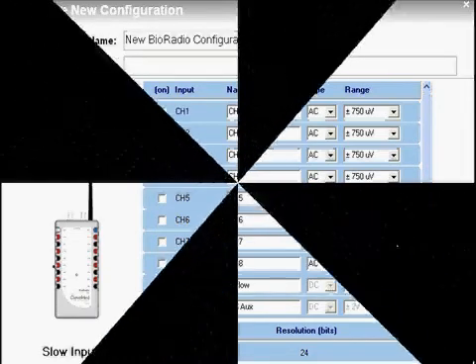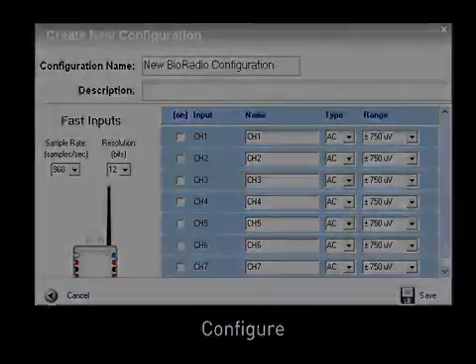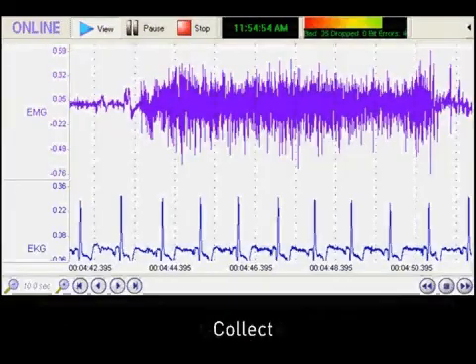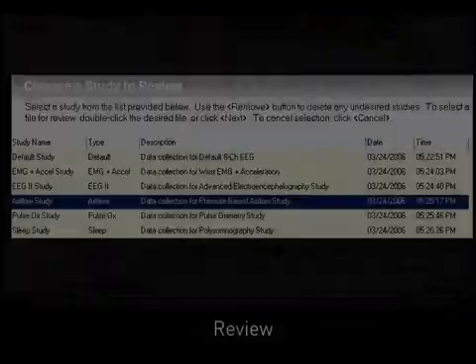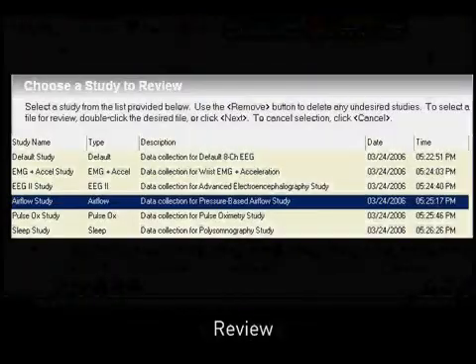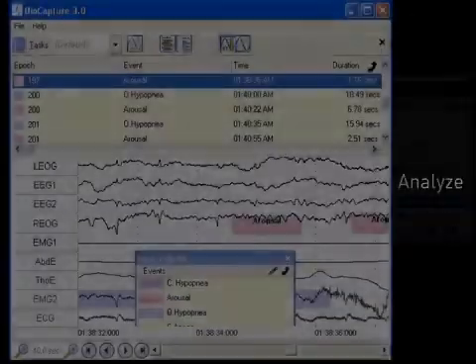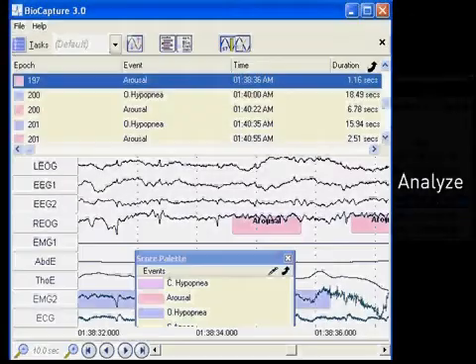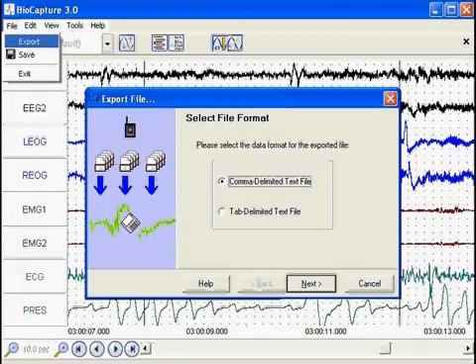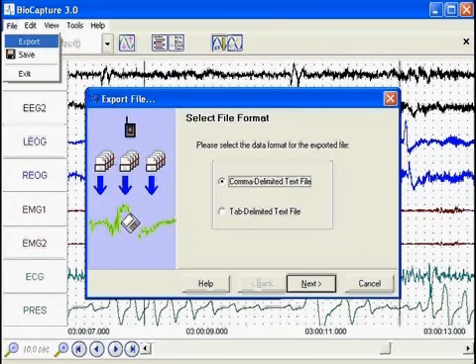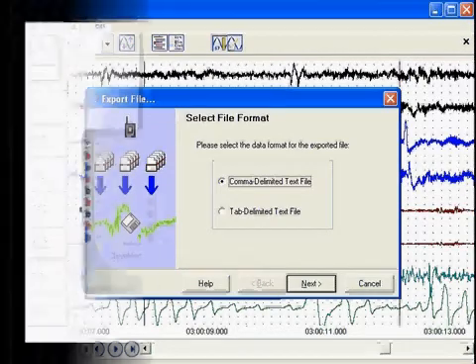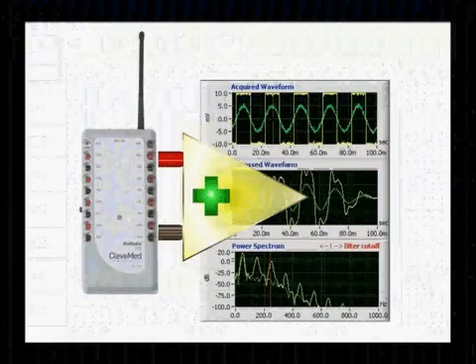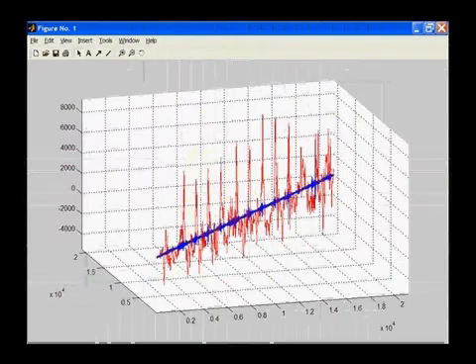In addition to the state-of-the-art hardware, the BioCapture software allows users to configure, collect, review, and analyze data in real-time or offline. Data can also be exported in ASCII format and incorporated into other analysis programs or into a research database. For even greater research flexibility, we provide a software development kit that includes LabVIEW and MATLAB drivers so that you can design any software interface around the BioCapture system.